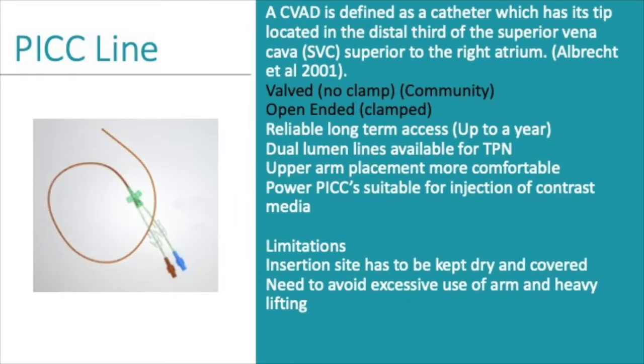Then you have PICC lines. PICC lines are fabulous. You can give a lot of medication through it, most medications. They are at high risk of infection because they are a central line. They can be in as long as the patient requires it. We've had one stay in up to 1 year before.